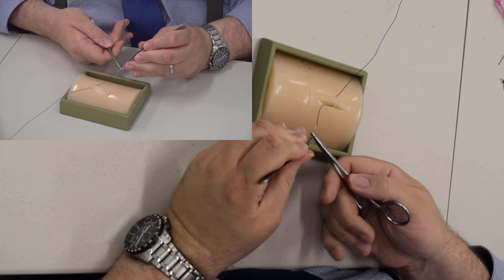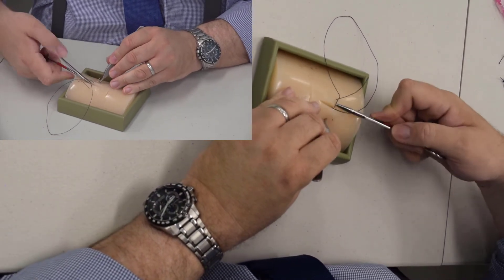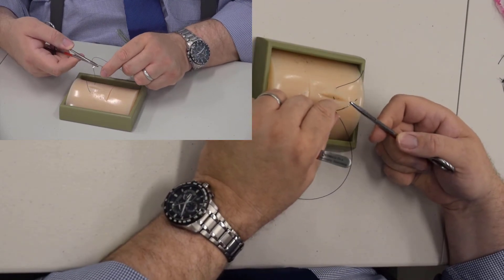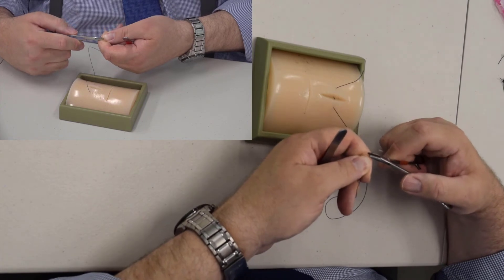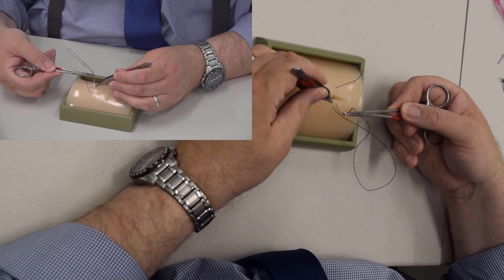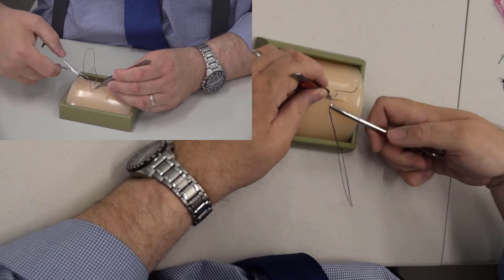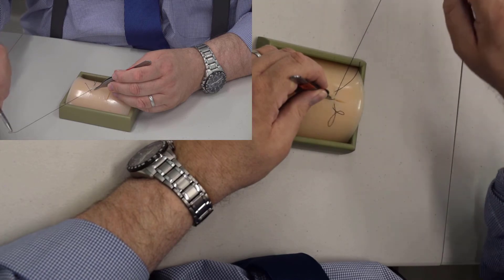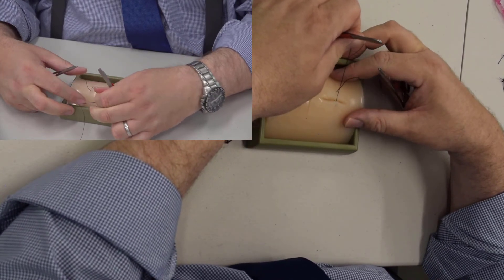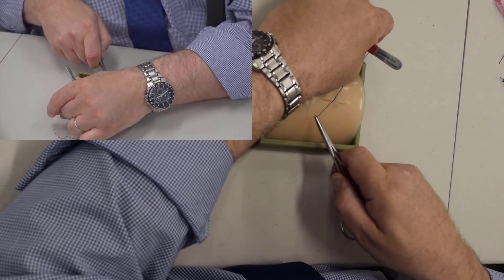Fingers are not in the holes. Same thing on the other side — start deep and come out about a quarter of an inch from the edge of the skin. Now reverse your needle and sew away from you. Load the needle the same way, but come right up to the edge of the skin — not very deep — on the other side, and pull it through. This is a vertical mattress stitch, and you do an instrument tie to put that together. This is done for deep lacerations, for example over a joint like your knee where you need more holding power.